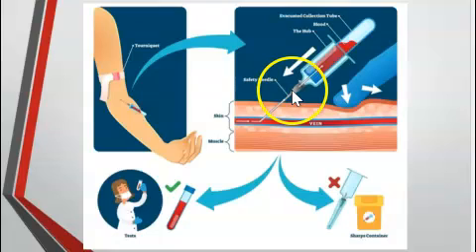so you're holding that vein into place. The needle is being inserted at the correct angle, and it's usually somewhere between 15 and 30 degrees. The needle is being inserted into the vein, and the blood is being allowed to flow into the tube. So when you're done with the blood collection, of course the needle is going to go into your sharps container, and then the blood tube itself can be inverted and mixed and go to the lab for testing.